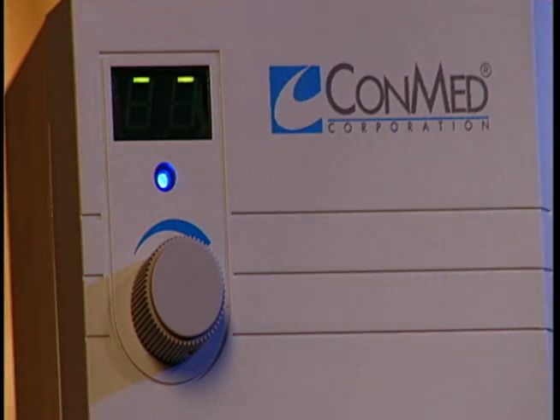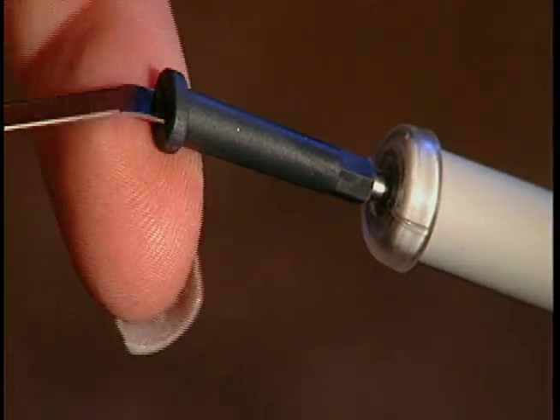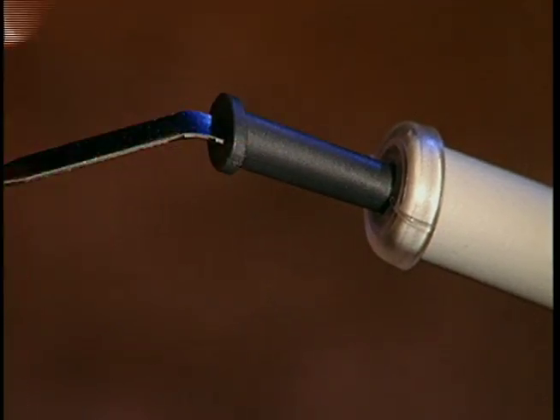Store three of your favorite power settings through the built-in memory, which retains the last setting used. Ensure electrode stability with ConMed's new anti-rotational cap, a feature exclusive to the Hyphricator 2000.